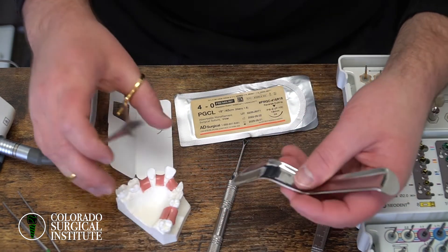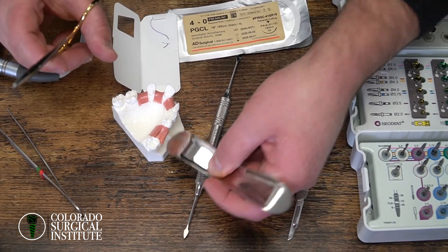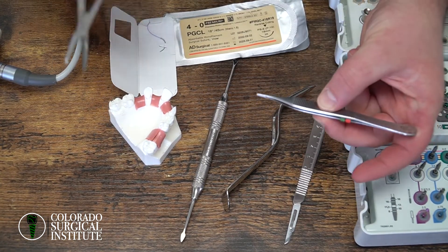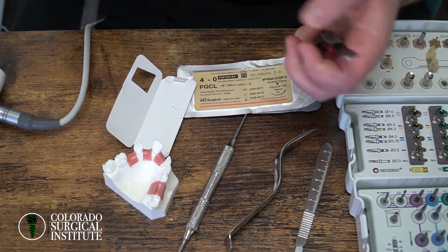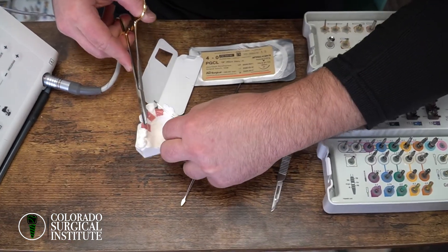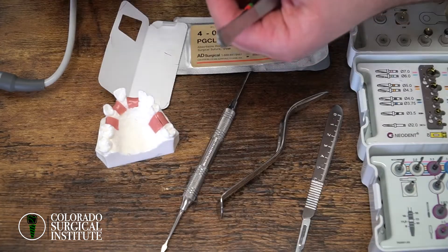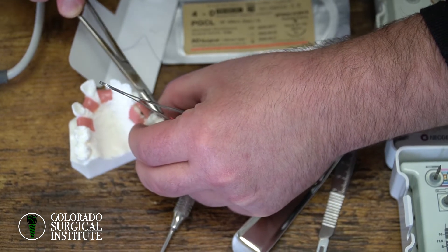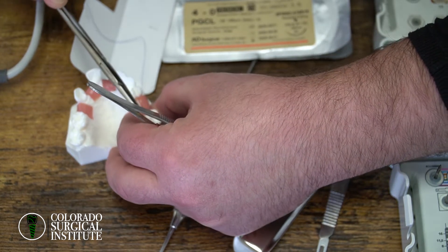With suturing, I'll have my assistant hold the Minnesota retractor so I have both hands free — a tissue forcep and a needle driver. Suturing is super important. Finishing this case and making sure things don't come apart is one of the most important things you can do. For these, I usually just put a simple interrupted suture, about two to three of them. You want a good bite of the tissue — at least three millimeters of tissue in your bite.